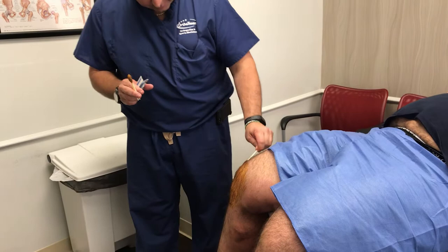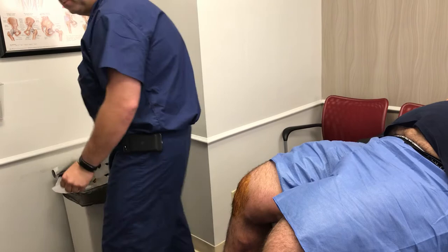Well, if it's coming from the meniscus, we will see that. Yes.